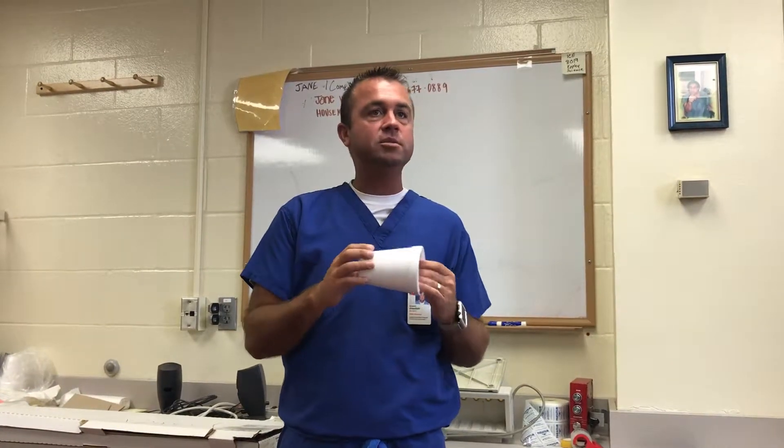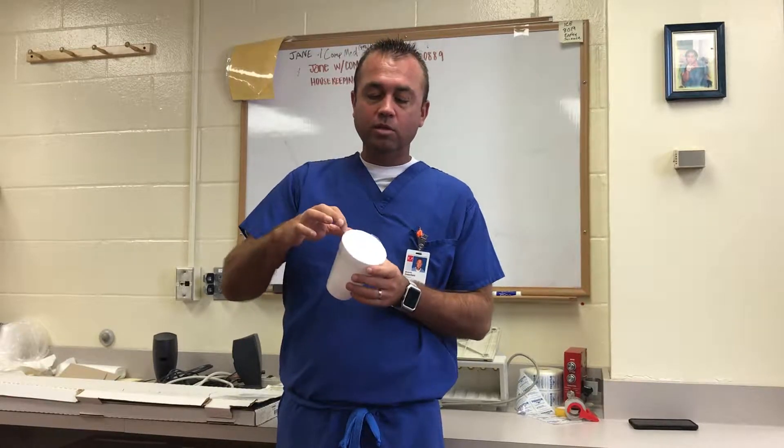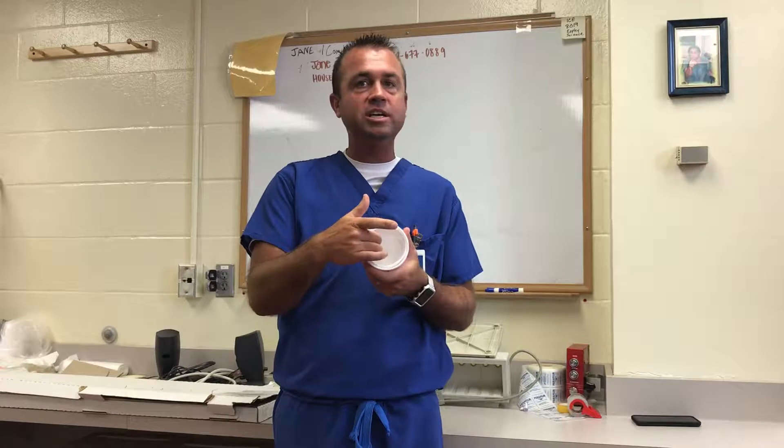This lab quest is going to be a demonstration of Seldinger technique of percutaneous line insertion and also percutaneous cannulation. We're going to have a series of two styrofoam cups, one inside the other, taped together. The opening is going to simulate the lumen of our vessel, the outside cup will simulate the skin, and the inside cup will simulate our vessel for percutaneous insertion.